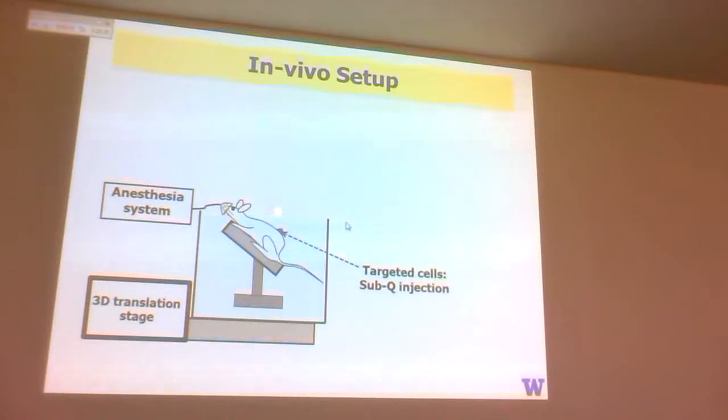So here's what we've done. We have our little mouse model. Oh, by the way, I should have shown this earlier. Almost all of the photoacoustic systems, the big spherical systems, and when you're doing small animal imaging, you put the animal in a water tank. Is that the iThera system? Yeah, but no, this one's us. It's the same type of thing.